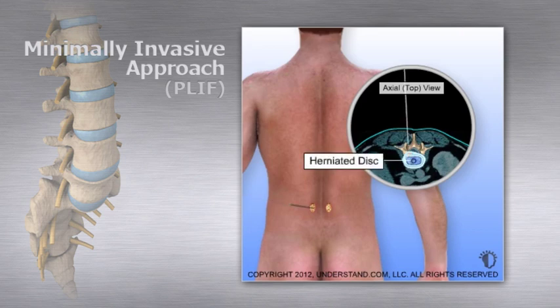Next, a thin wire or needle is inserted through tissues and muscle to the level of the spine on each side. Special dilators are guided down the wire to separate muscle fibers and provide access to the underlying spine without cutting through the muscles.